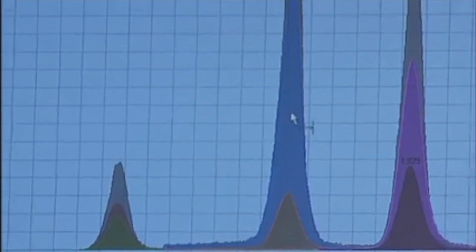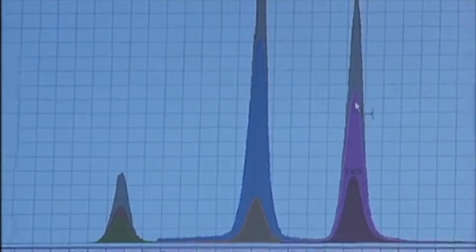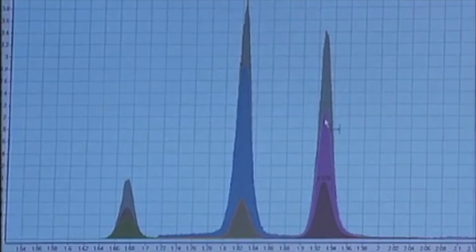We're going to use our MassHunter software here. We can look here at the transition parameters of the 3 compounds we've screened. Our analysis is complete, and our total time for this method, including sample prep, is just a few minutes.